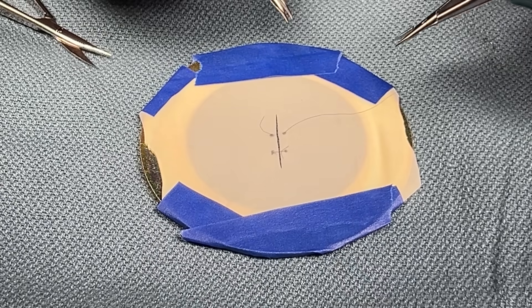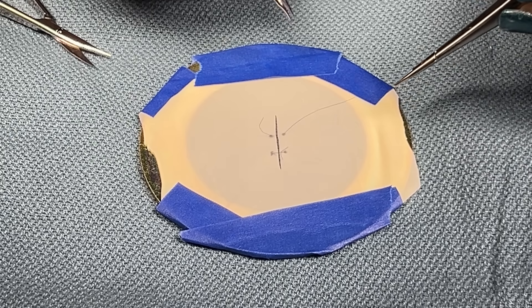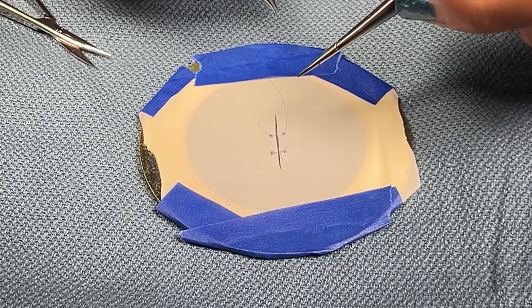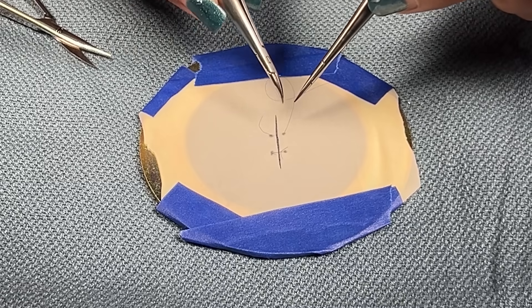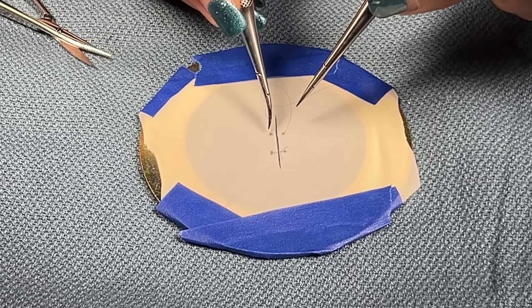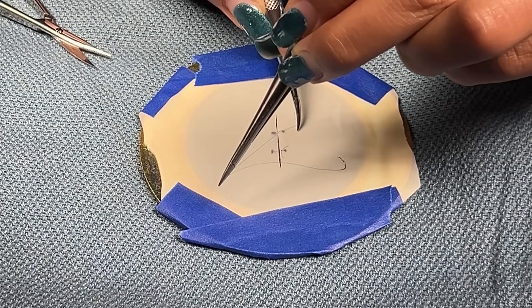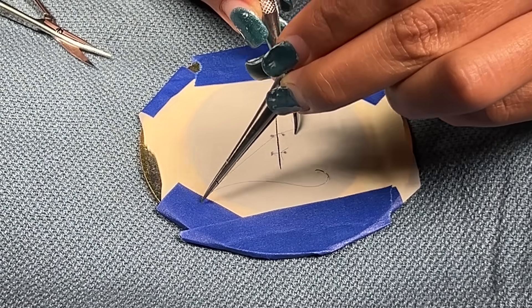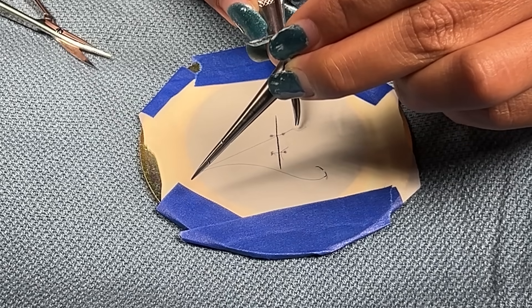Using your forceps, you're going to grab the long end of the suture. You're going to bring that up towards the tail end. Using your driver, you're going to go under over to grab the tail. You're going to pull the tail end, then let go of your tail end.